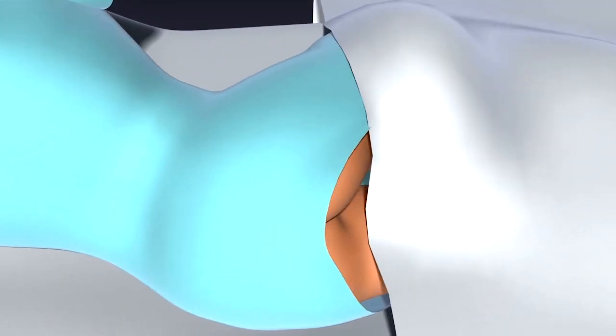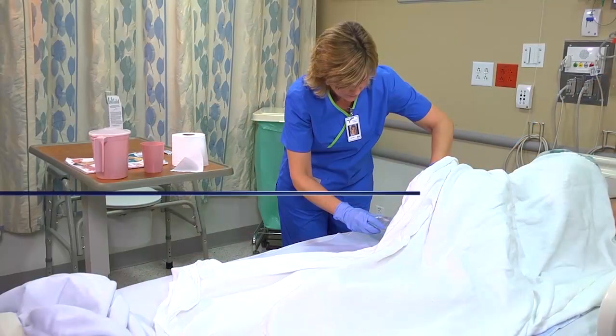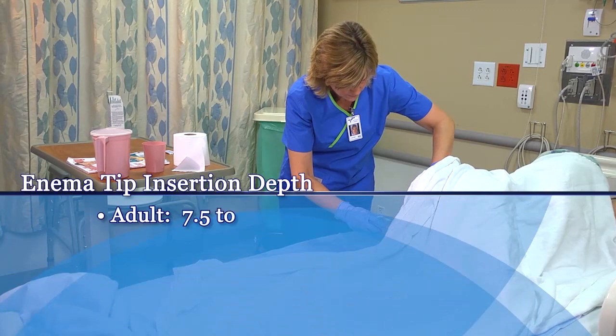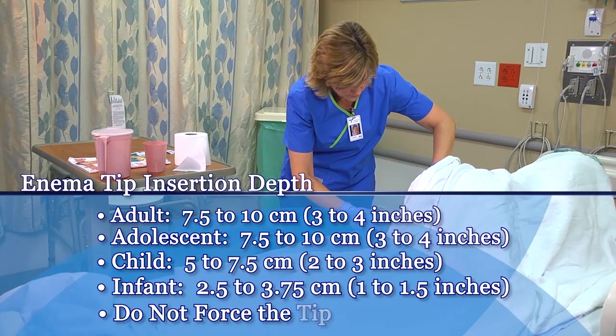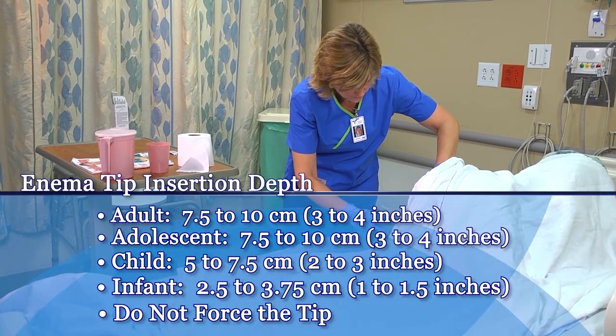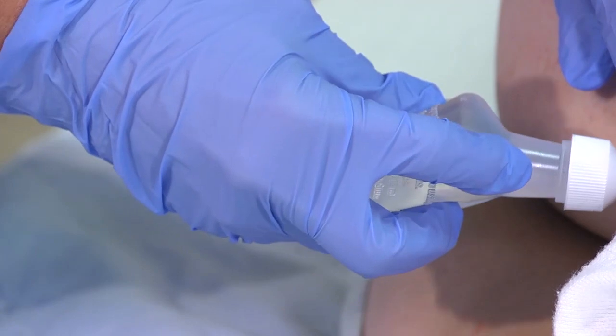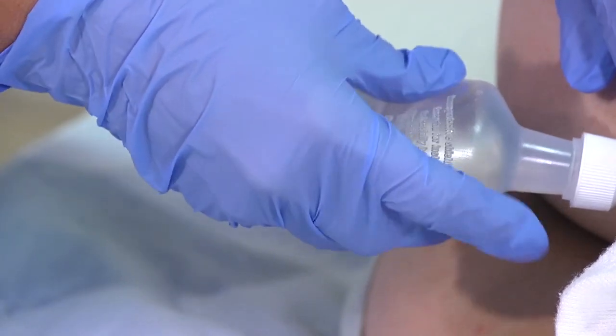After expelling any air from the enema container, gently insert the lubricated tip into the anal canal, angling it toward the umbilicus. Adjust the insertion depth based on the patient's age. In any patient, don't force the tip if you feel resistance. Stop the procedure and notify the healthcare provider.